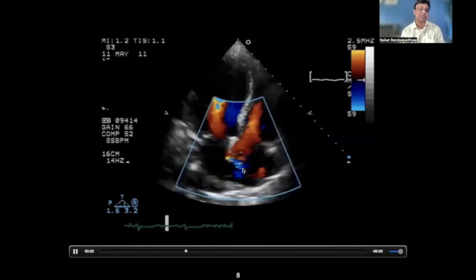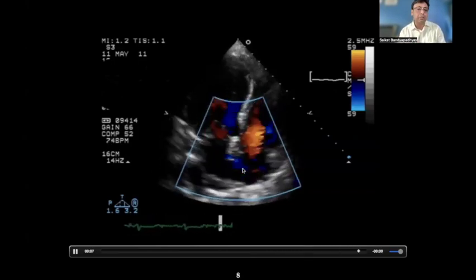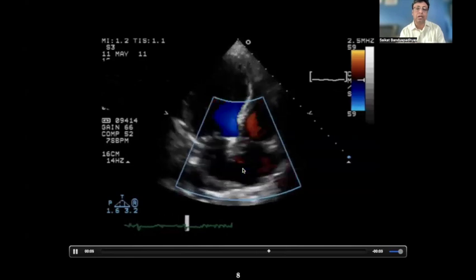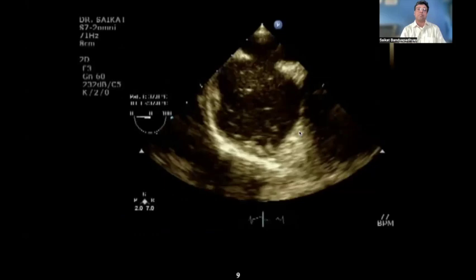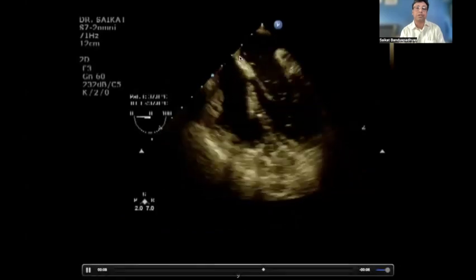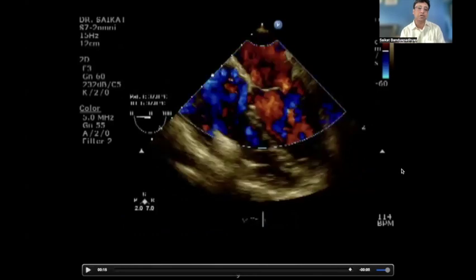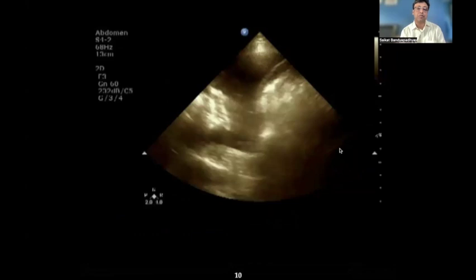Although this is not the same patient, this is from a different patient, just to show the kind of thing that we're looking for. But this particular patient we are talking about had a really small leak, so that leak could not account for it. So this is the patient we are talking about. This is the ASD from before the operation. After the operation, you can see there's a patch closure and a very small leak over here. So it's almost non-significant. So I assured him that maybe this is not the heart, it's something else. Then we went on looking somewhere else.